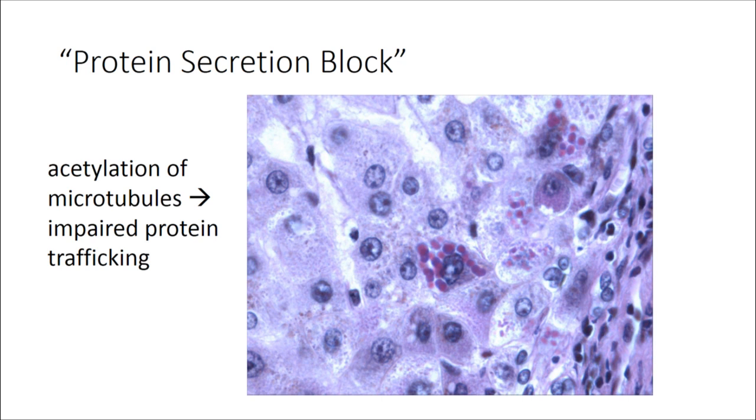So the ballooning degeneration does, in point, represent the fact that the cytoskeletal network has undergone degradation. As well, particularly in the setting of alcohol use, one may see PAS-positive, diastase-resistant globules within the hepatocyte, particularly around the peripheral area. While this may make one think that the person additionally has alpha-1 antitrypsin deficiency, more often than not, the person does not have that underlying problem.